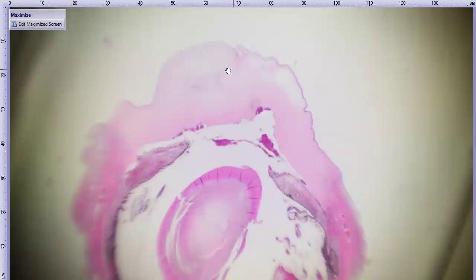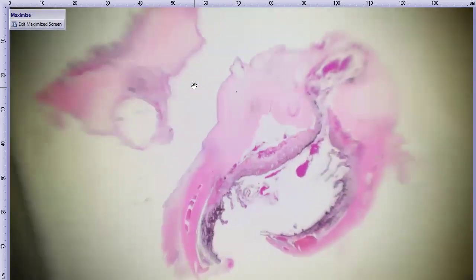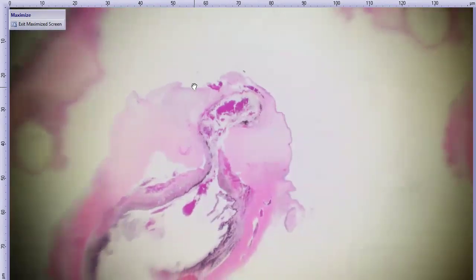So there's maybe a little tiny bit of faint basophilia in the corneal stroma as well, which is some sort of infiltrate. We'll look at it more closely, but I'm going to switch to our other slide, which better captures the perforation site. So here is what we call a nanner or a banana of the globe, where we have some sclera. Here's ciliary body at both sides, iris leaflets right there, and then here's the cornea. So you can see that there's a defect in the cornea, and the iris leaflets are prolapsing up into that defect. So this is our corneal perforation, and this is just another section of it as well, where we're just catching the area of it.